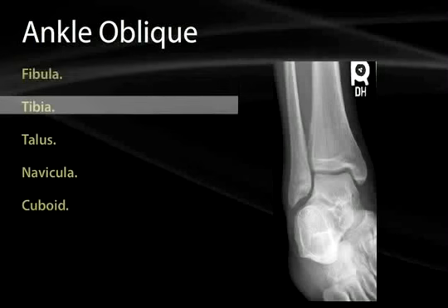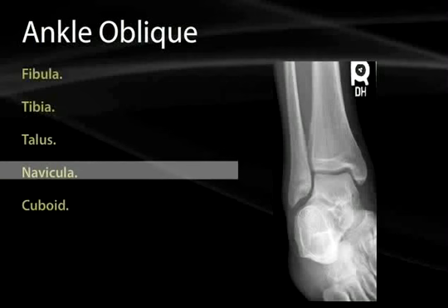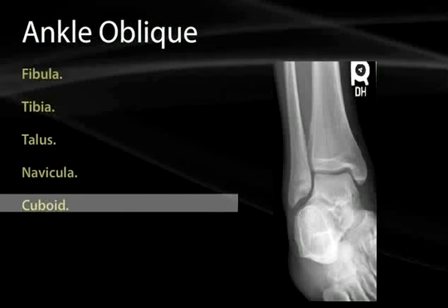On the tibia, a very broad bone, look for osteosarcomas in the central medullary portions, avulsions off the bottom edges of the medial malleolus, and any pits or cracks along the base of the tibia where it articulates with the body of the talus. The talus has a nice round head and a saddle-shaped body where it articulates with the tibia at the talocrural joint. Then you can see the boat-shaped navicular and the square cuboid, though the cuneiforms are not well visualized.